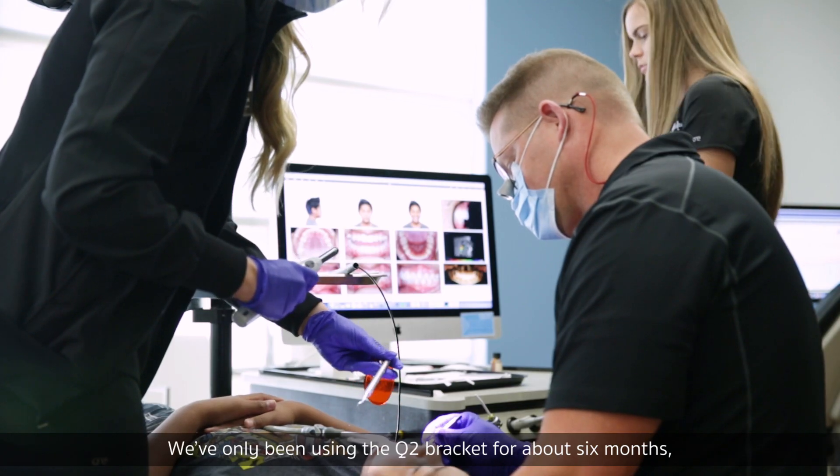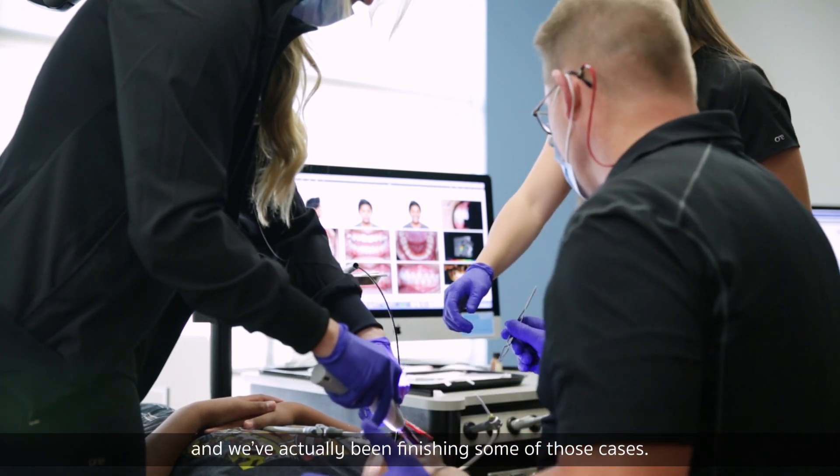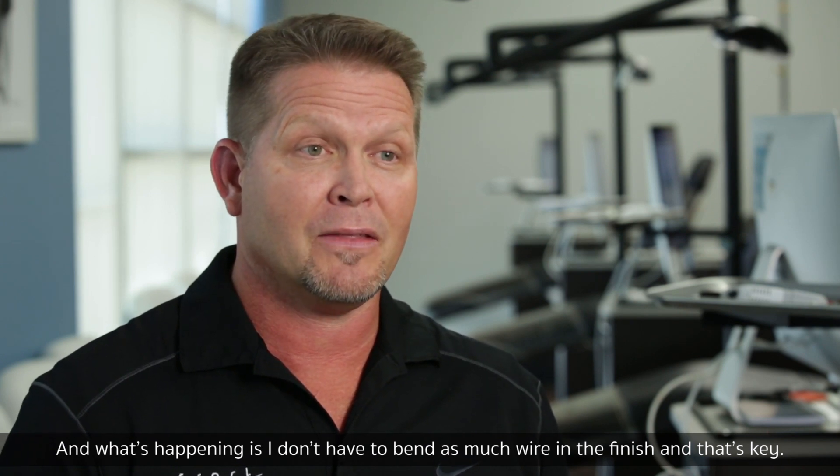We've only been using the Q2 bracket for about six months and we've actually been finishing some of those cases. What's happening is I don't have to bend as much wire at the finish. And that's key.